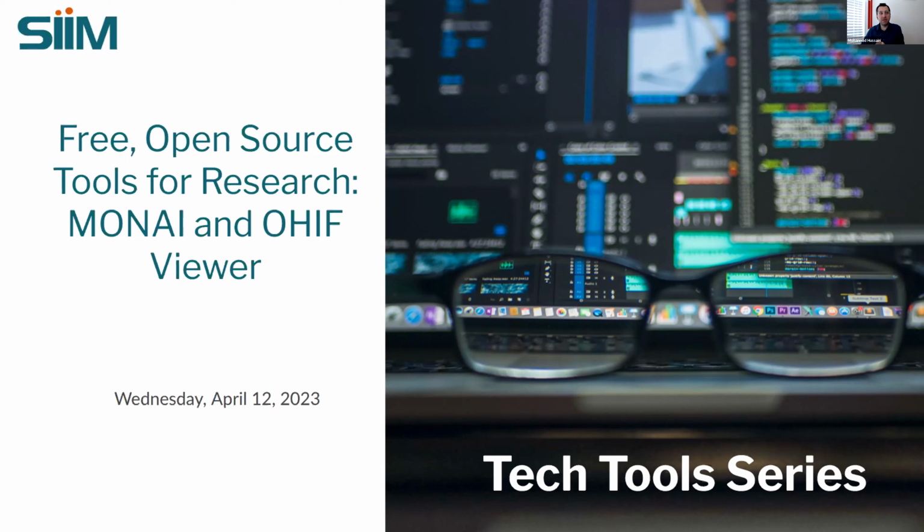So today is the free open source tools for research, MONAI, and OHIF viewer. It's actually three presentations today. So we're going to hear first about the OHIF viewer. Then we're going to hear about MONAI, an overview of the entire project. And then last but not least, we're going to hear about the integration of OHIF and MONAI.